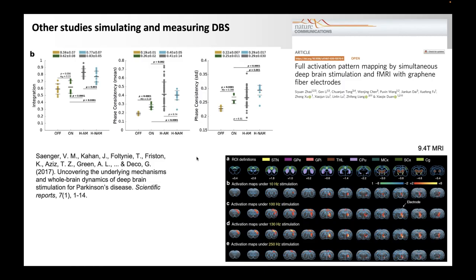And when we look at the on minus off periods, subtract them from each other and normalize, you can see there's a lot going on in motor, but there's quite something going on in frontal still, and the temporal lobe should not be forgotten either. This is the data of one individual Parkinson's disease patient, just to show you where this is heading and how we can take into account even more detail in the same simulation.